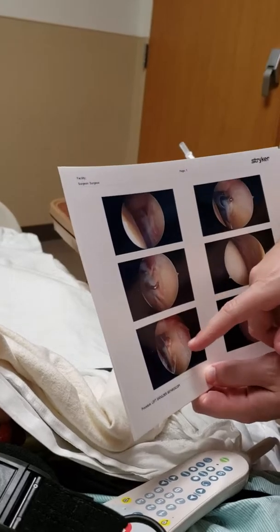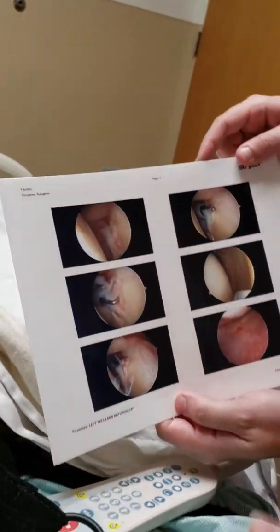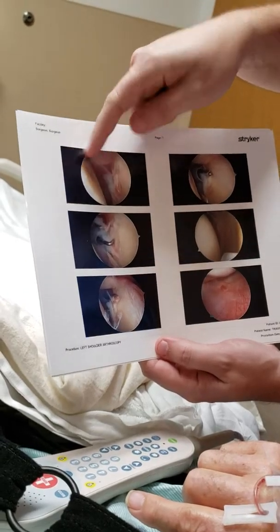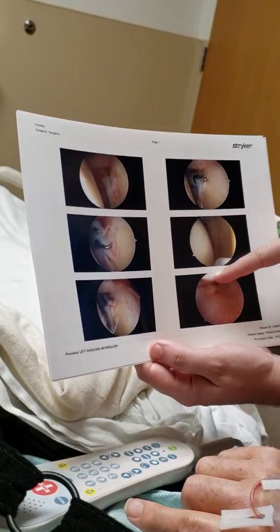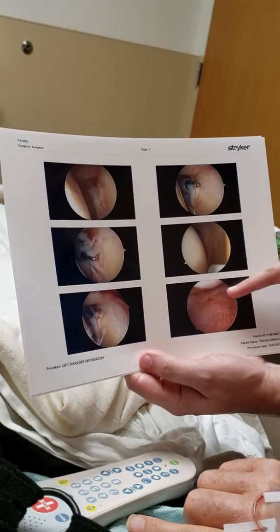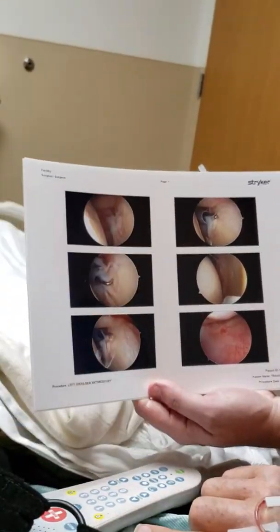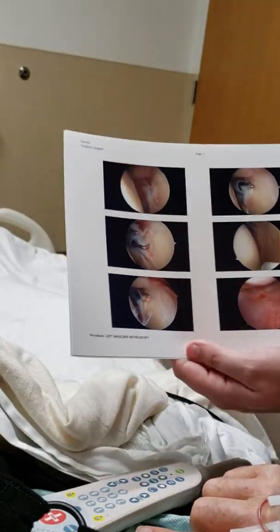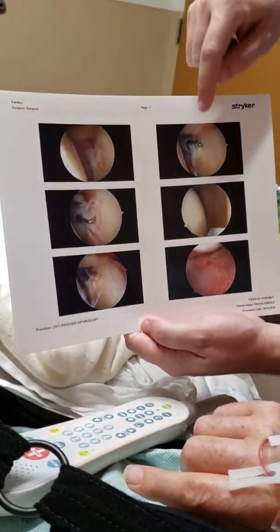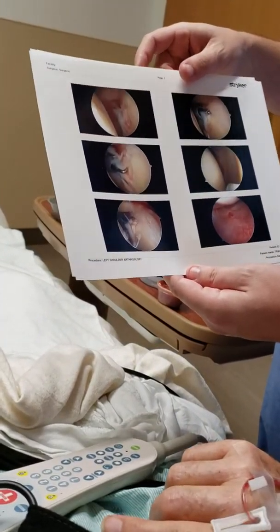Here we're looking at the top of your labrum and this is the biceps tendon coming into view. Actually this is below the socket now — we're next to the socket and then we dive below it, so the socket is above us. Here's the pouch below. We look for loose bodies — you don't have anything in there. That redness you see is inflammation, red streaks — just like an angry, painful shoulder. That's pretty common. The pain comes from both the swelling and from the tear.